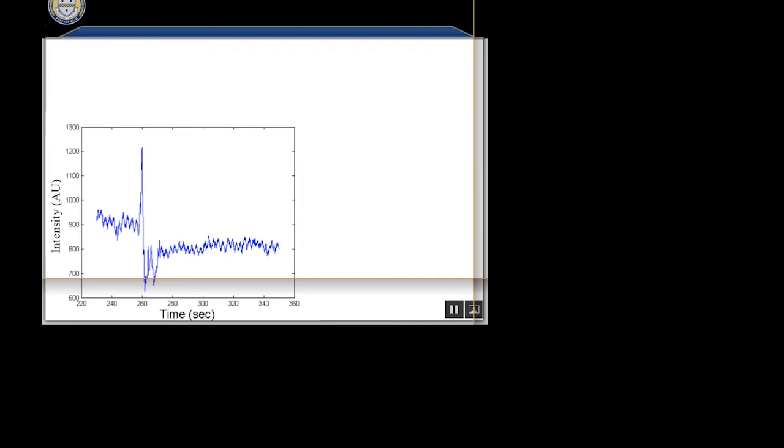Okay, so I showed some data before that was nice and clean. You clearly saw the responses, but most of the time your data looks a little bit more like this. We clearly have a motion artifact in the data. Motion artifact for fNIRS is when the probe moves relative to the head. I can move around all you want. I showed yesterday all my work with gait, mobility, and stuff like that.